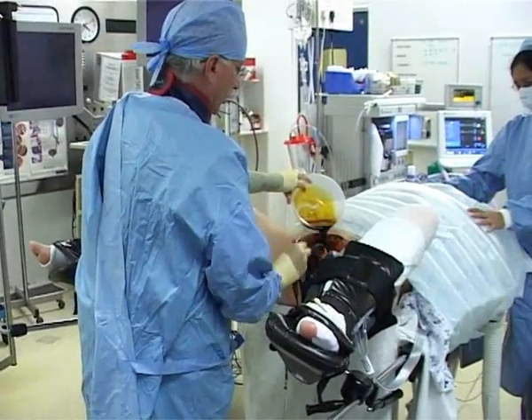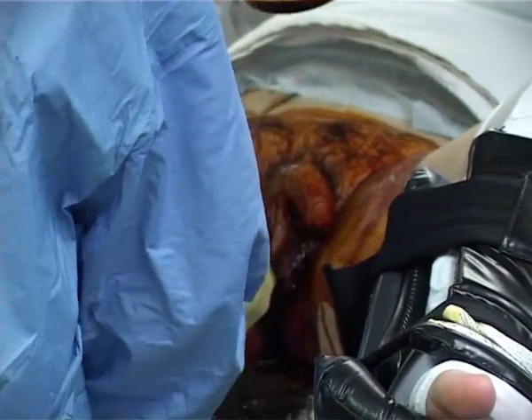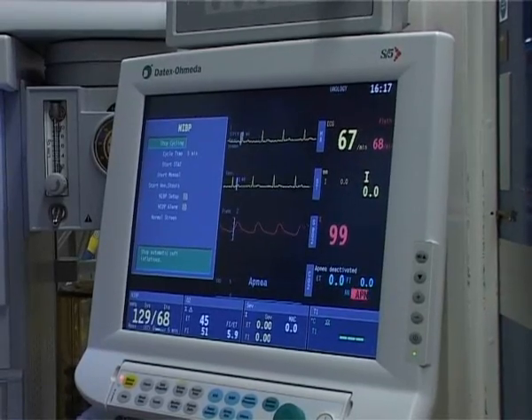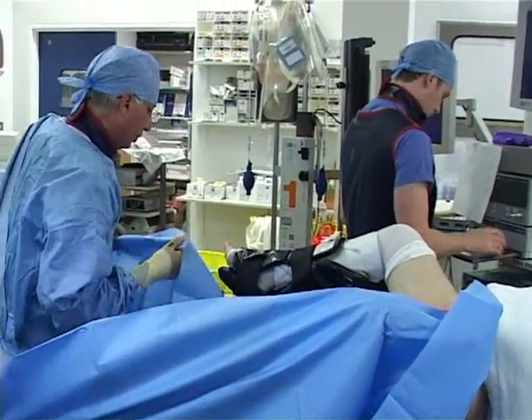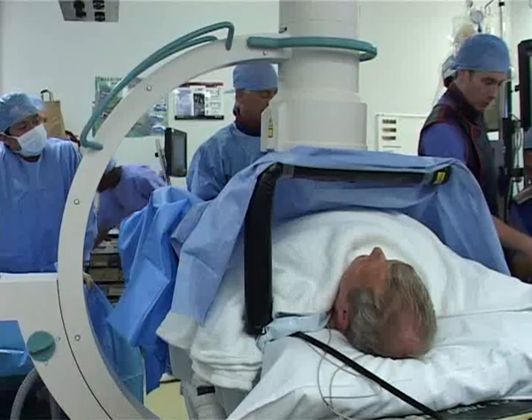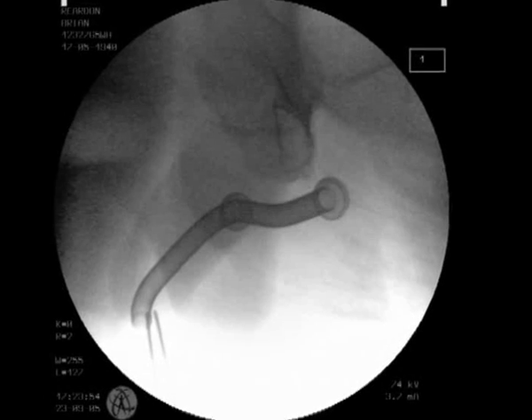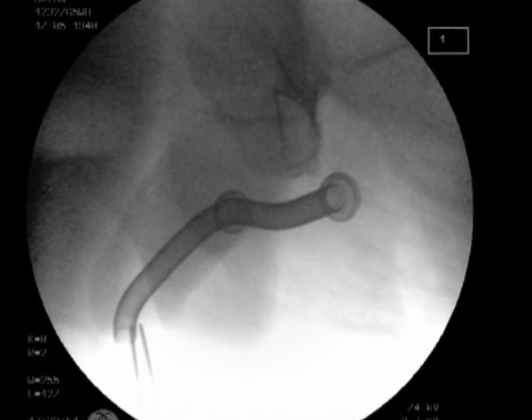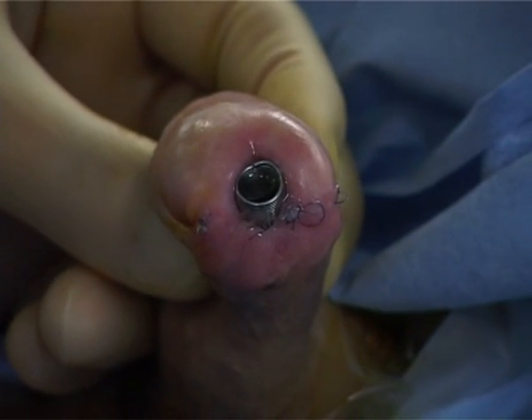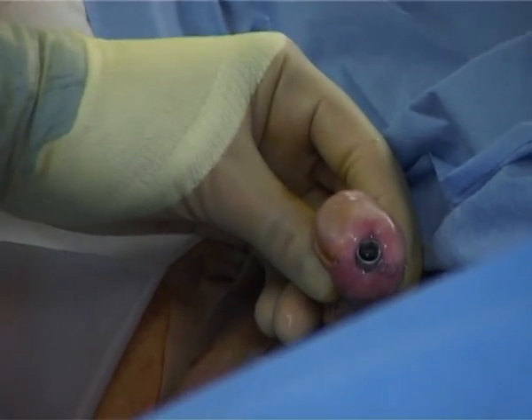Today we will demonstrate the exchange of a urethral Memocath. This patient has extensive medical comorbidities and a long recurrent urethral stricture from the bulbourethra to the distal urethra. He also had a meatoplasty in the past. He had 2 urethral Memocaths placed adjacent to each other. However, the distal end of the distal Memocath was protruding and causing discomfort.